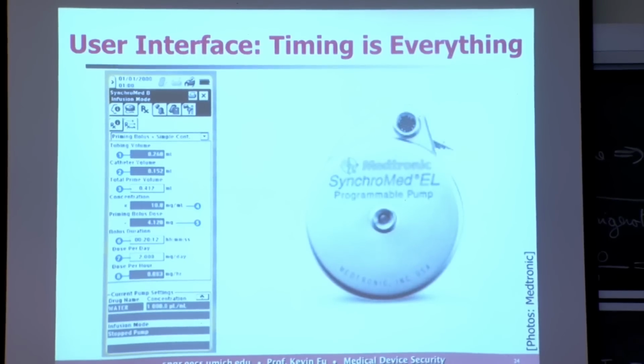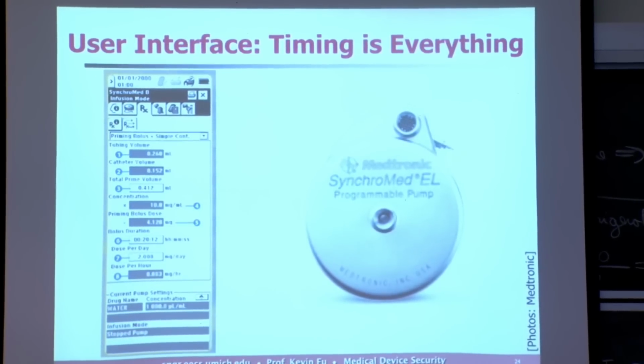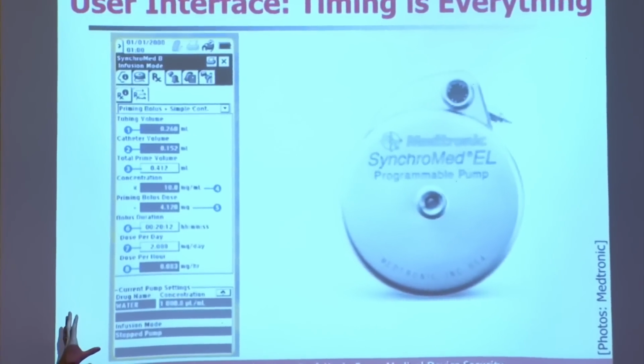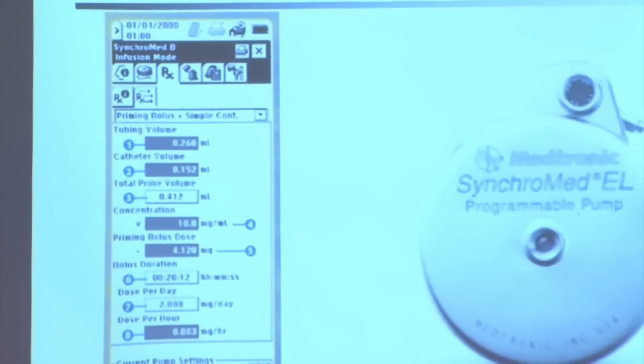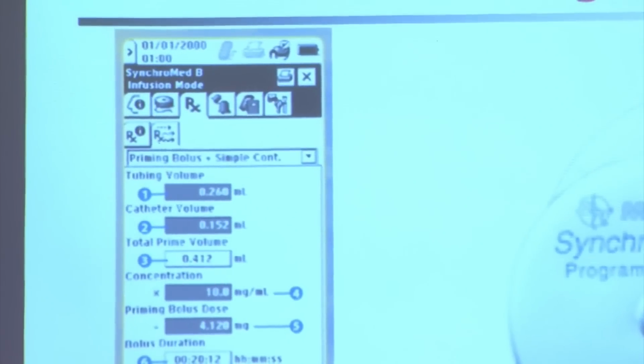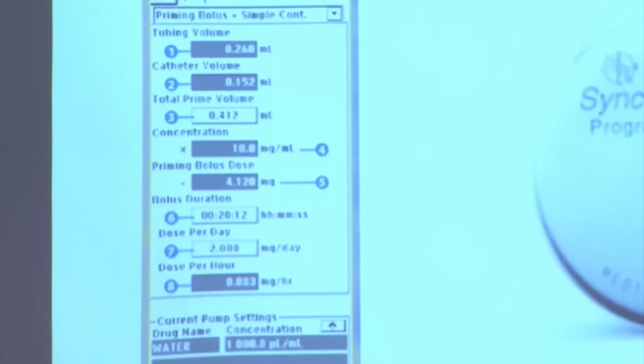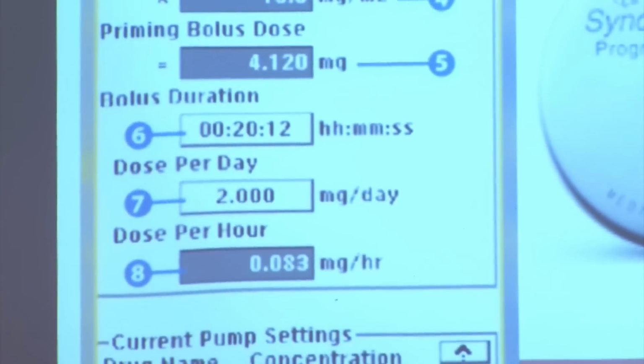There's also an implantable kind of pump. They're not just bedside pumps, the kind you see on daytime hospital dramas. But here's an implantable pump, and you can see it's got this semi-permeable membrane where you can replenish the drugs. And this is a user interface that the nurse or the clinician uses to change the dosage rate. So does anyone see where you type in the quantity of drug? You've got to squint, right? So you squint really closely.